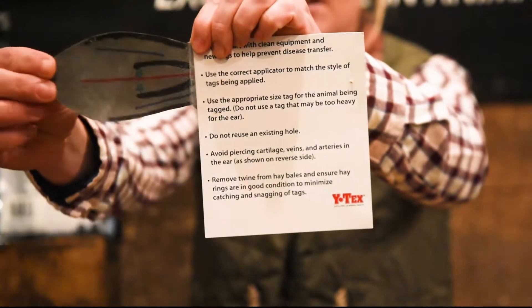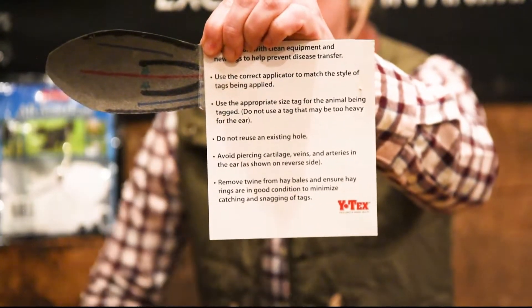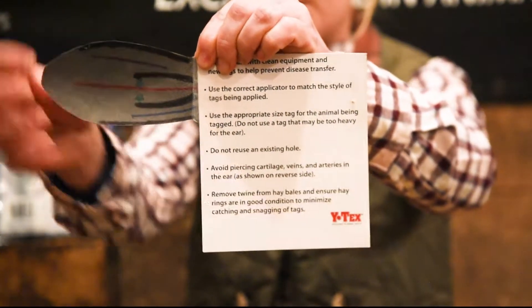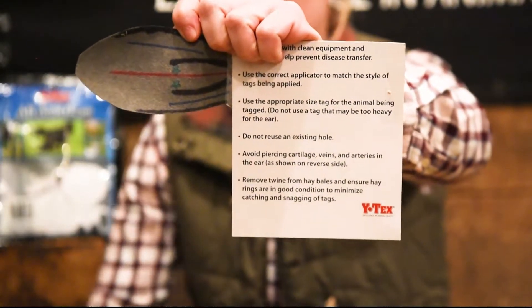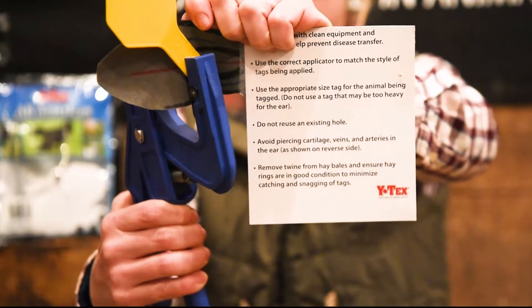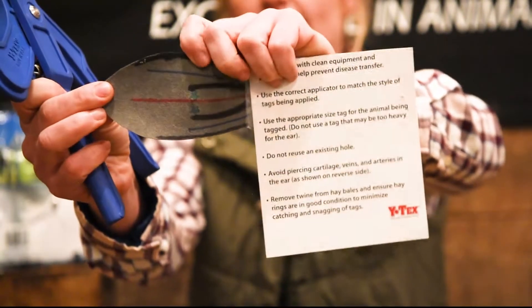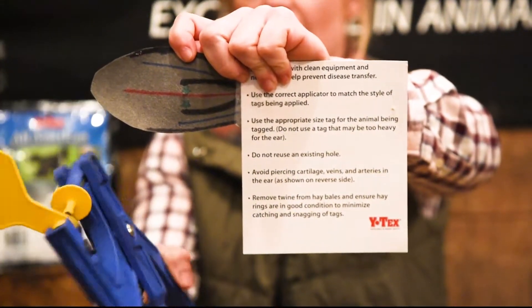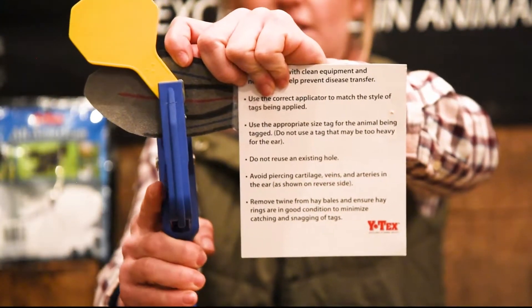A newborn calf's ear is very flimsy. So when tagging the ear, we want to make sure that we hold the ear tight or taut. I'm going to show you if we don't hold it tight, we drag a lot of tissue into that hole as we're piercing it. But if we can hold that ear very tight and we tag the calf, we make a much smaller hole, easier to heal.